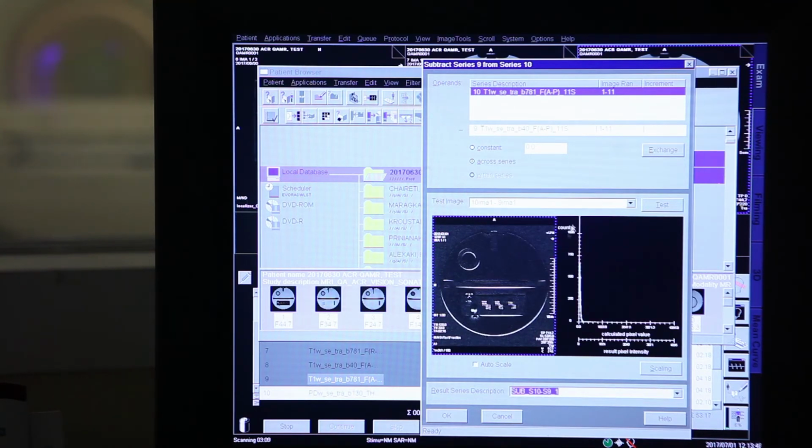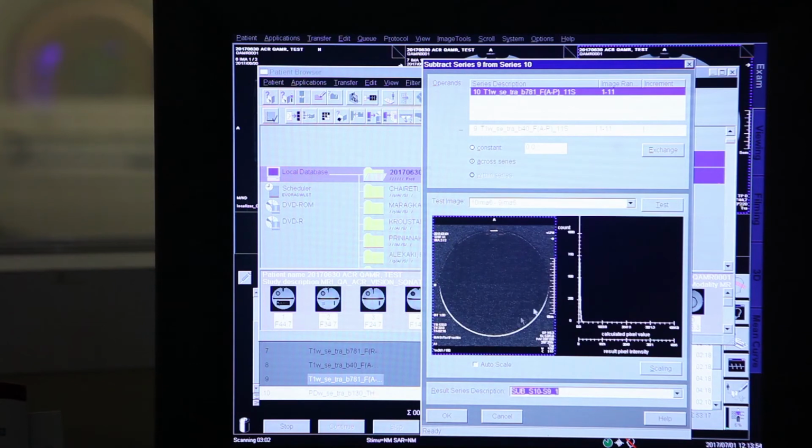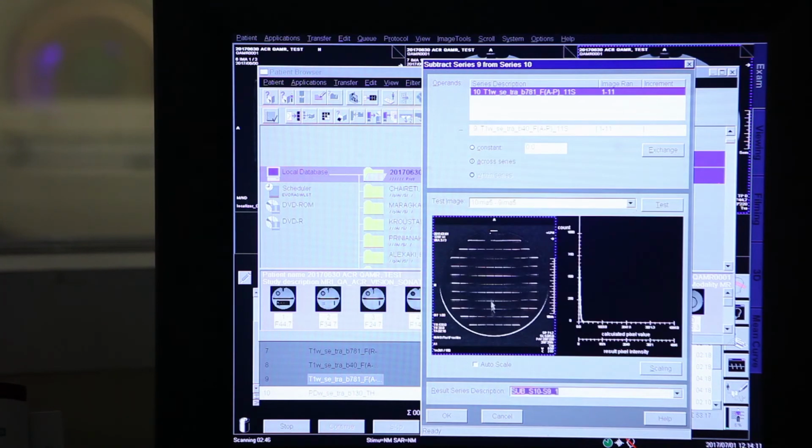Now, you can take and check number 6, as I was saying, and there you measure. Be aware that at the middle, you expect to have a better homogeneity, at the center of the magnet. So if you have a structure here, like we have in slice number 5, you don't expect to have shift here, because it's better.